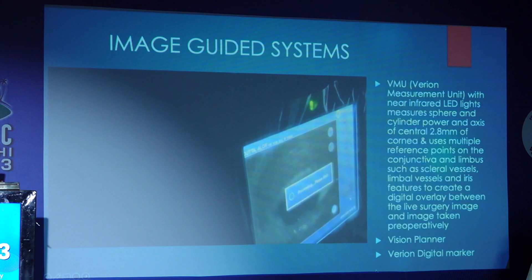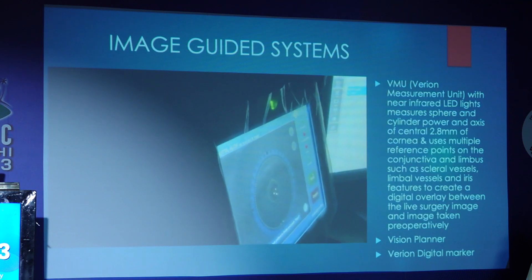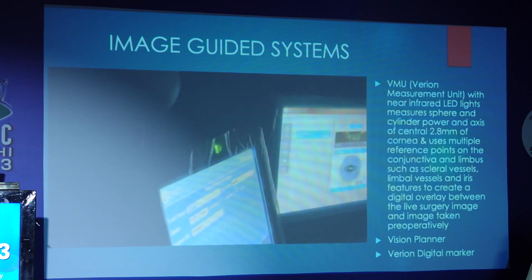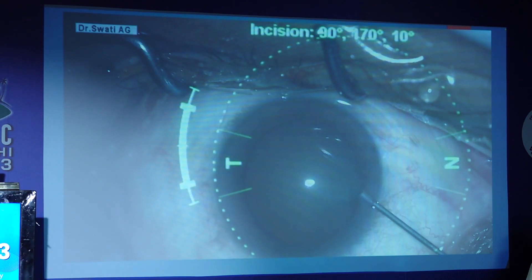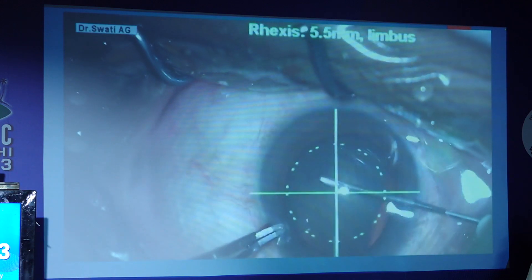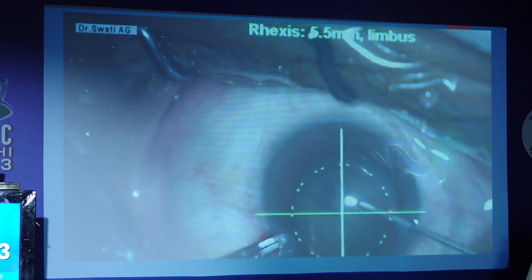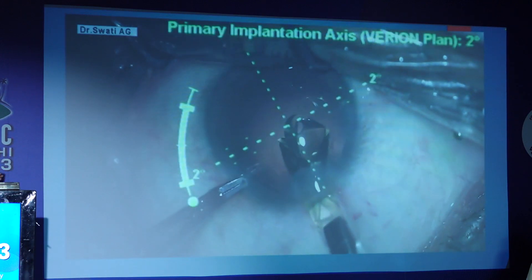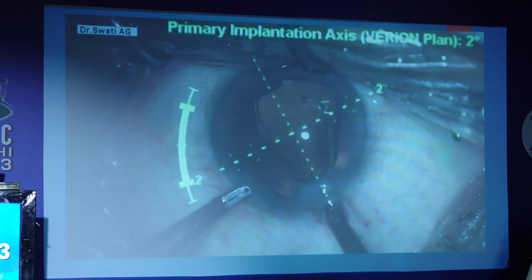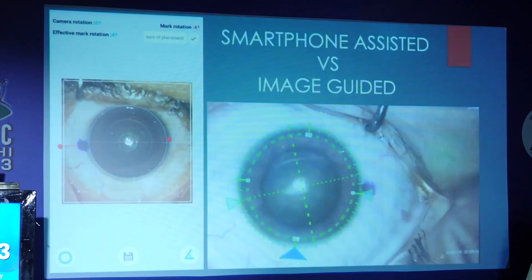The data is passed on to the Vision Planner and then to the Verion digital marker. This helps in reducing surgeon-induced or assistant-induced transcription errors, which is very important. The image guided virtual marking can be seen here, and we also get to see the rhexis marking. The cataract is proceeded just like a normal cataract, and even for the IOL implantation, we get the axis and the IOL is implanted on the axis accordingly.